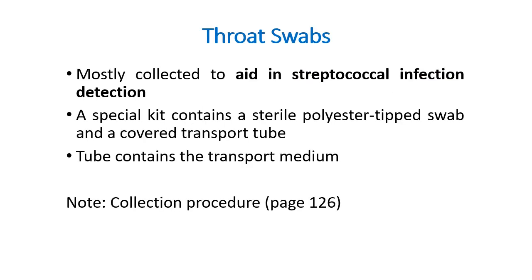We also have throat swabs. It is used to aid for the streptococcal infection detection. So, pwede nyong makita yung procedure sa page 126 ng book nyo. Anong ginagamit? Sterile polyester tip swab.